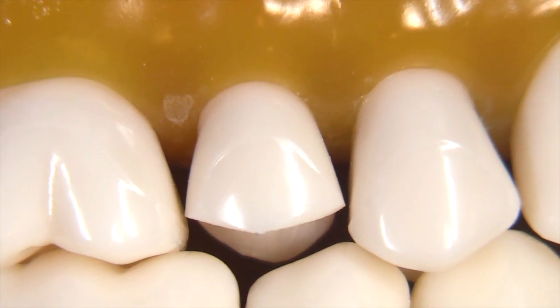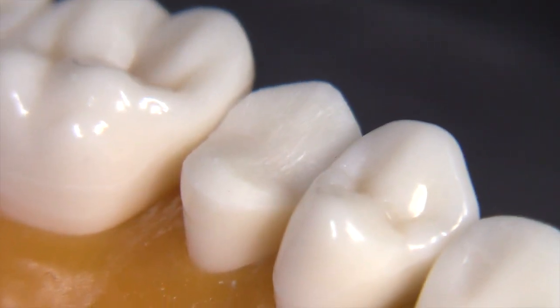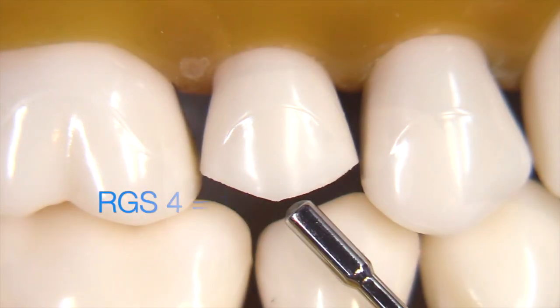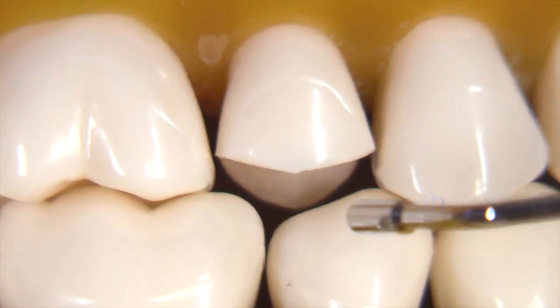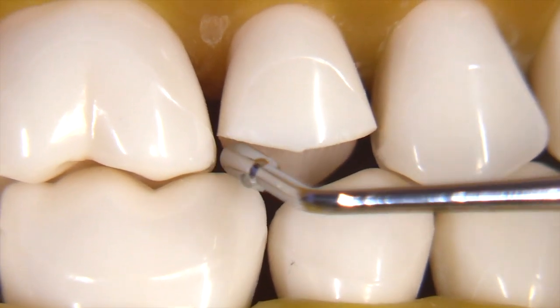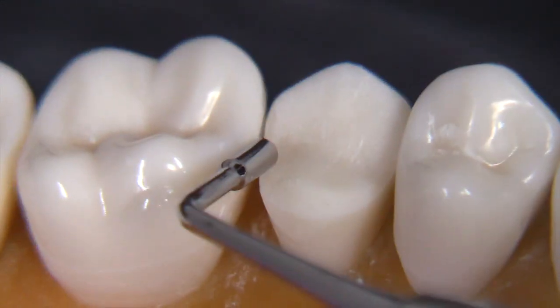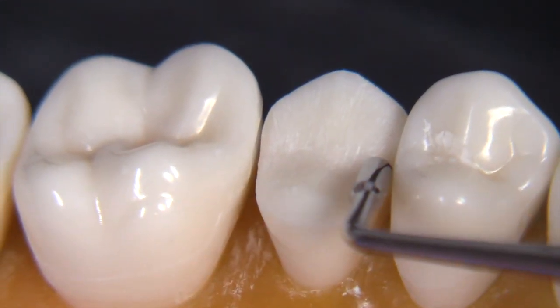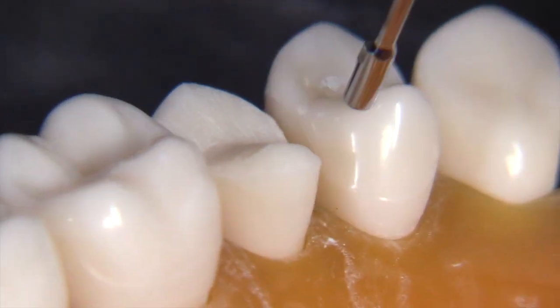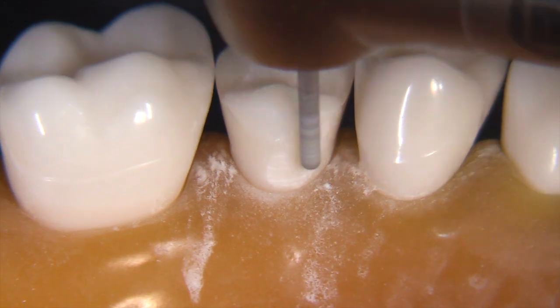It's always a good idea to take a look at your preparation midway through from the buccal view to see how well the reduction is going. You can see we've got the three planes — A, B, and C planes — being made on this occlusal. This is an RGS4, which measures 1.5 millimeters in width, and you can see it wiggles a little bit in there — that's exactly what we want. We can also utilize the instrument from the side. It's often really difficult to obtain proper lingual reduction, so it's nice to check the distance between the marginal ridge and the tooth reduction area.